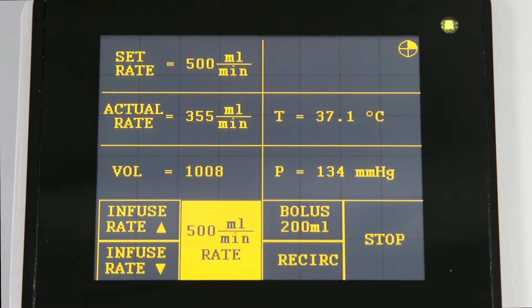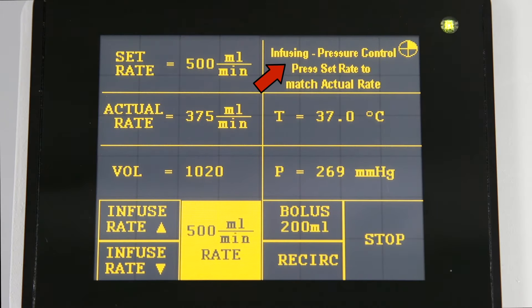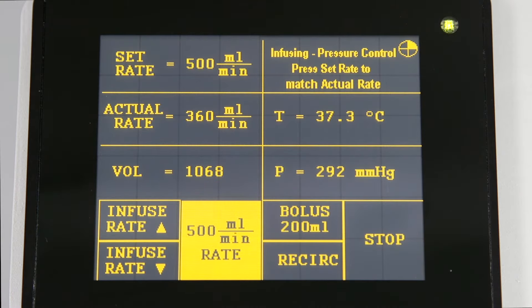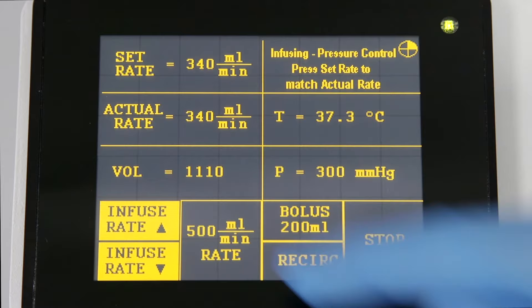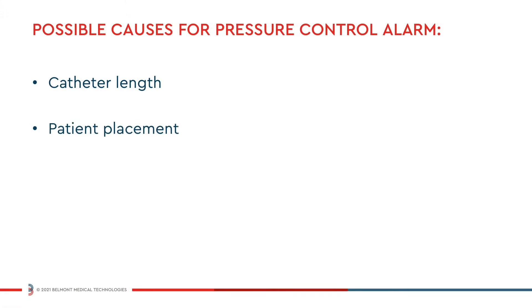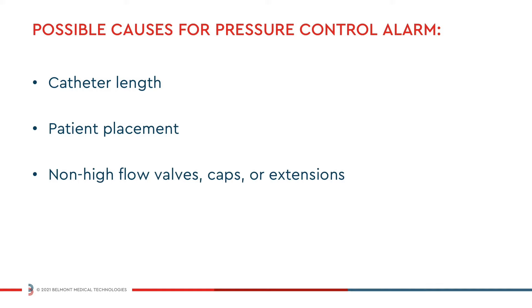Pressure control will display when the set rate is higher than the maximum allowable infusion rate. Infusion will continue during the pressure control alert but will be automatically regulated within safe limits. To silence the alarm, press the set rate to match the actual rate. Catheter length, patient placement, and non-high flow valves, caps, or extensions may all reduce the maximum achievable infusion rate.